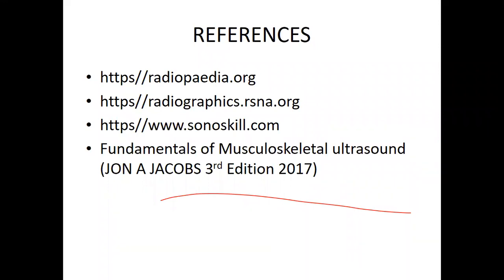Again, if there is anyone with normal nomograms, I still have to learn. But what is also coming out in the literature review is to be familiar with the normal variants, the normal anatomy, and its appearance on ultrasound, taking into consideration the techniques. Remember, anisotropy may also mimic some tears and fluid collection. And then also consider the clinical history of the patient. Thank you. Unless there is anyone who can add on to those.